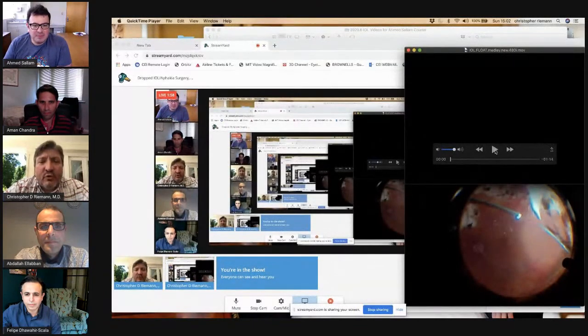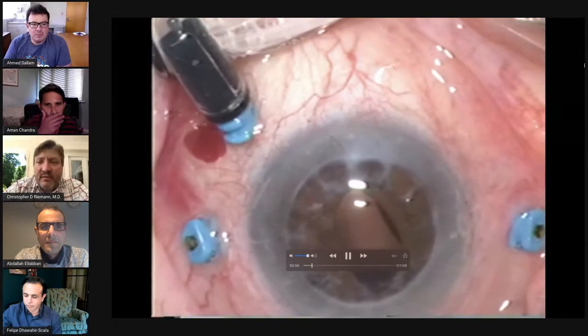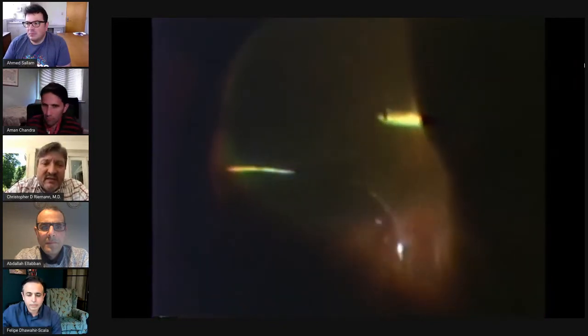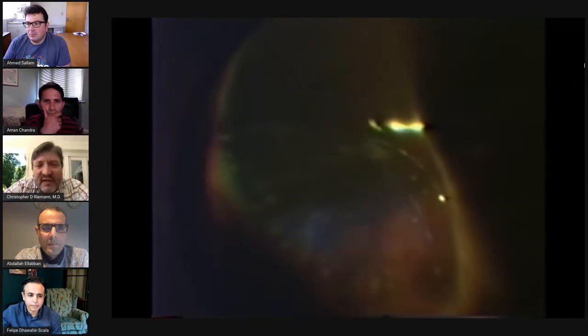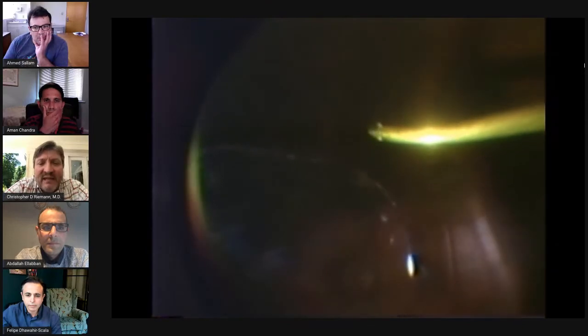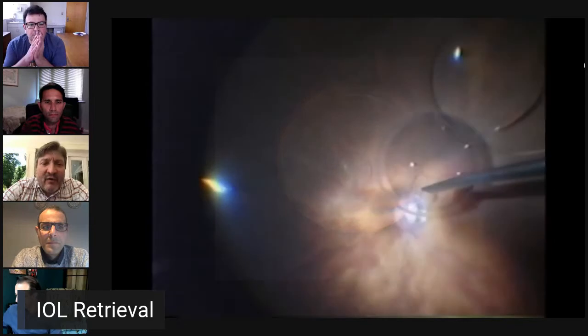So I've got two short videos. One is kind of a medley on how to lift these lenses. Here's a lens that's loose. It's entangled in the vitreous. The first thing you have to do is really make sure that the IOL is free-floating and disentangled from the vitreous. So here we finally got it out of the vitreous space.